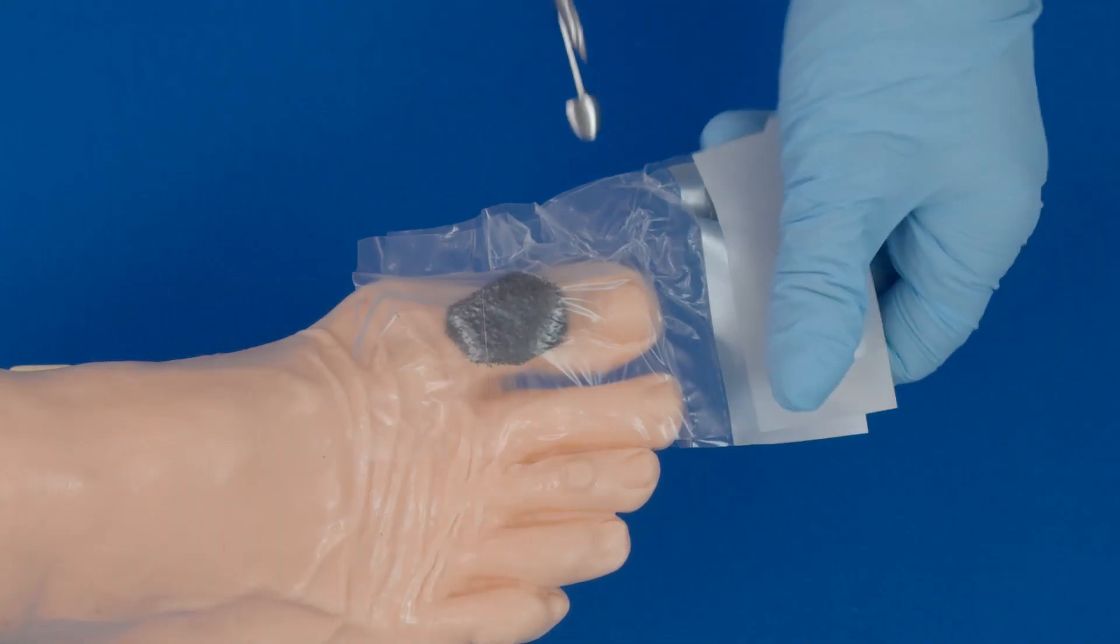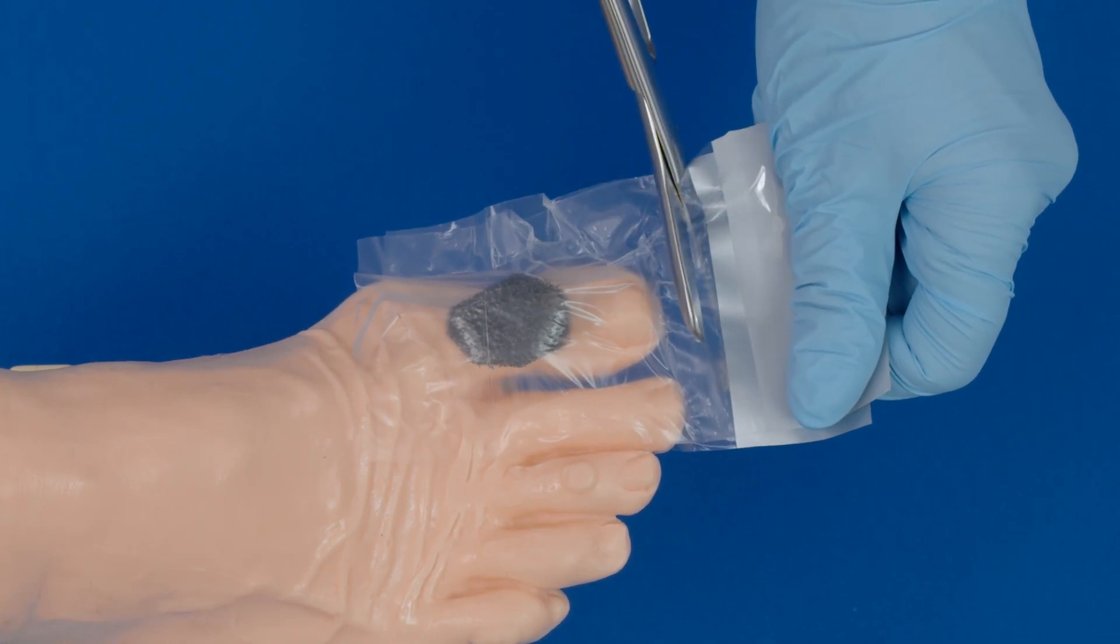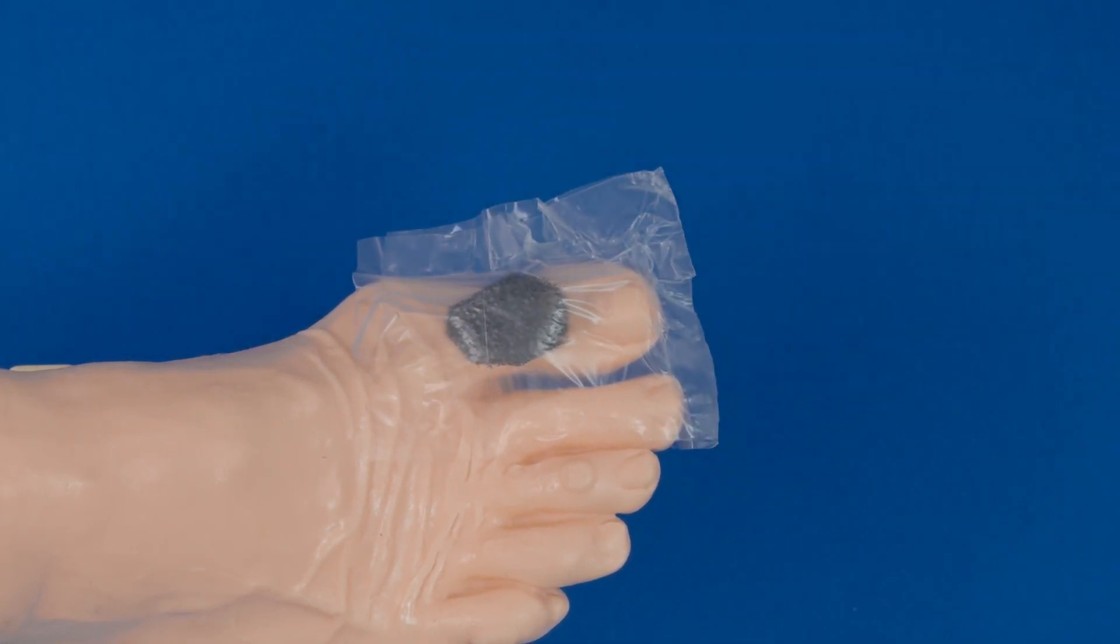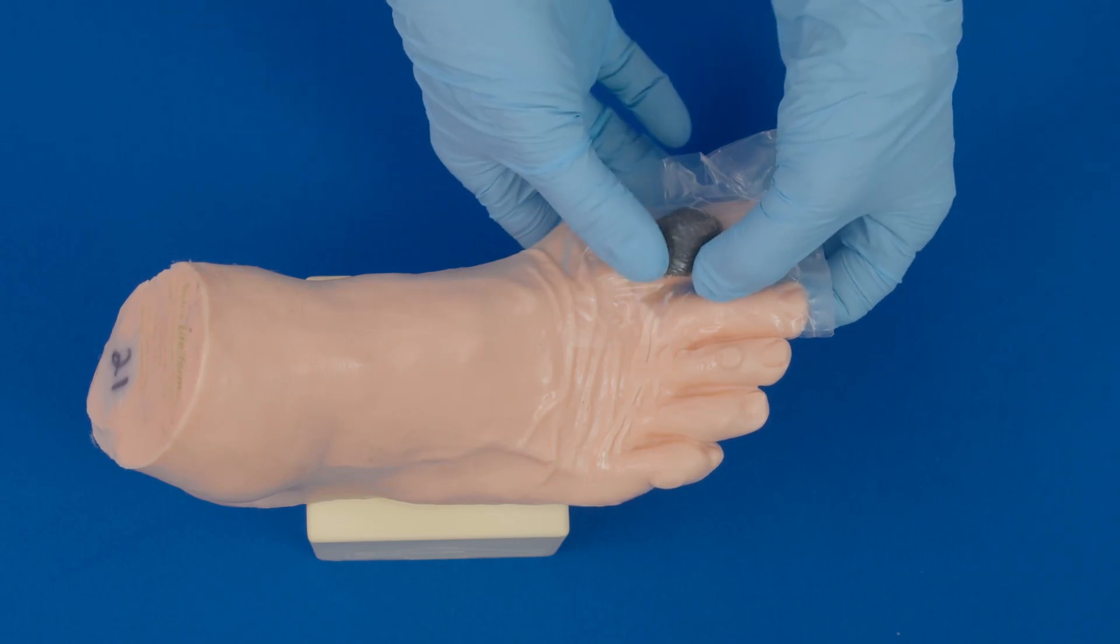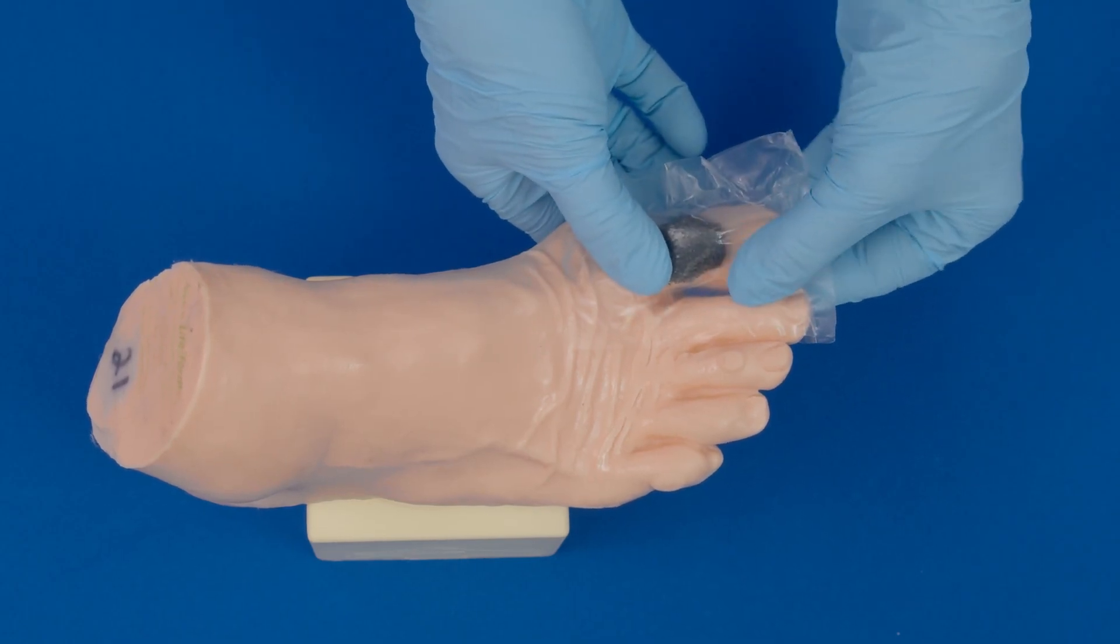Then you are able to cut the hole over the wound and place the fit pad, or you can then bridge over the transparent film.